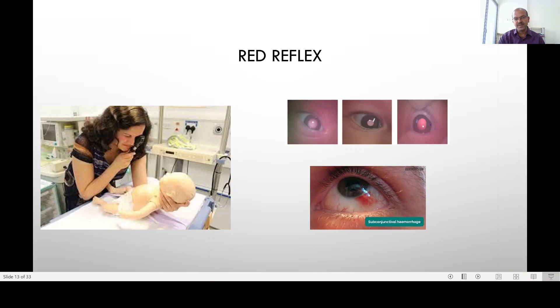You keep the ophthalmoscope next to your eyes and look into the baby's eyes. This doctor is holding the baby up, but you can also keep the baby on the crib or request someone else. You may need to separate the eyelids. When the baby is quiet, you can separate the eyelids and see the red reflex quite easily.